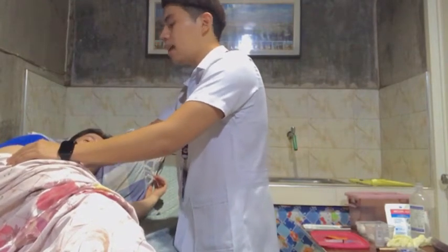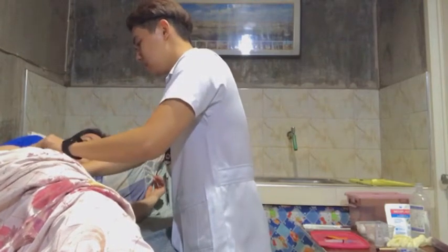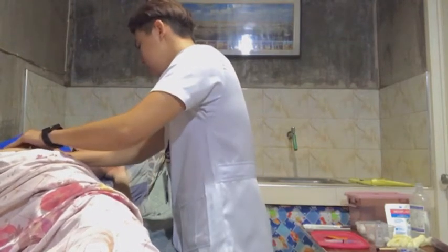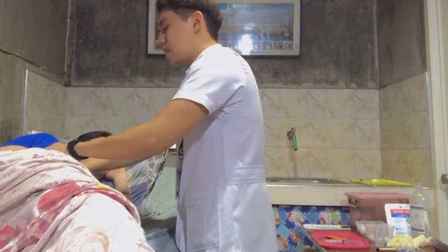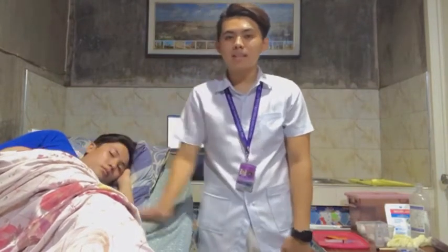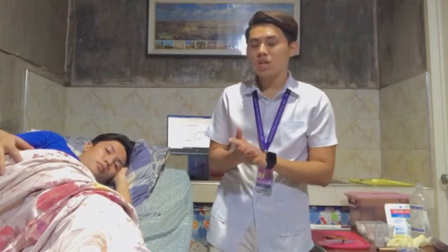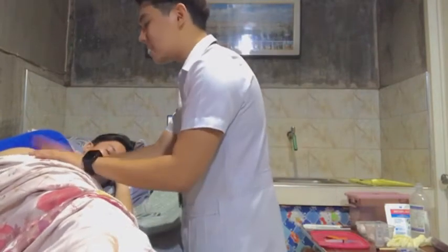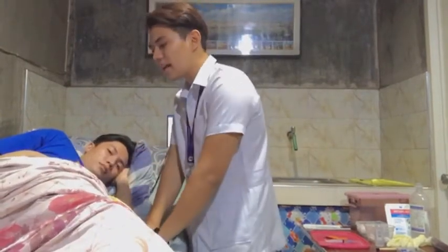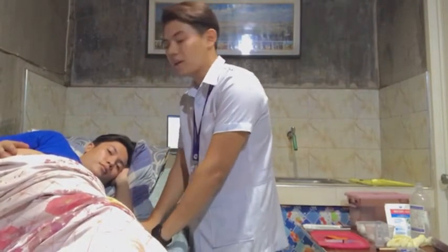So let us do a deep palpation rather. Do you feel any pain? So this is the indication that we can now proceed to the next step. Of course, we will also be inspecting the area for any bruising, inflammation, and edema. And if the skin shows bruises or inflammation, use the other sides. So as I can see here, as I inspect, there is no redness, bruising, or edema for the patient, so we can proceed.